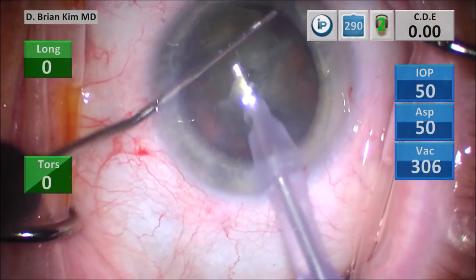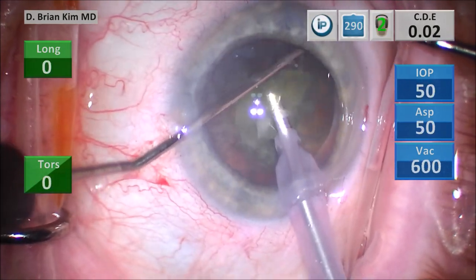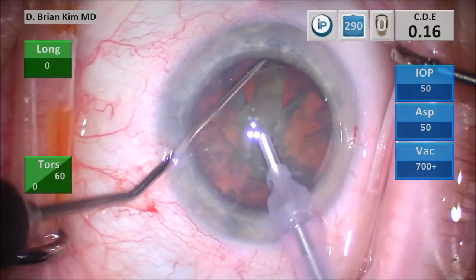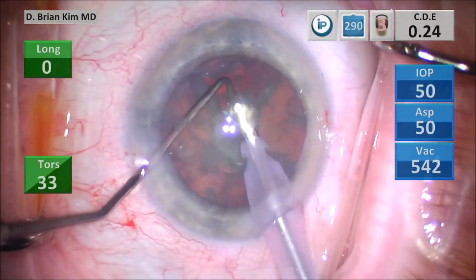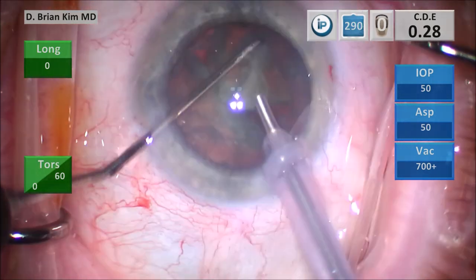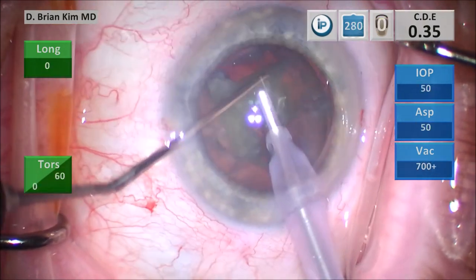I place the chopper out to the contralateral equator, crushing it, pulling it towards the center towards the phaco tip, and that crushes and divides the right hemi-nucleus. You can see that first quadrant just popped out of the bag, so I'm using mechanical fracturing forces to sandwich and crush the lens between the chopper and the phaco tip. I'm placing the chopper out to the equator again with a modified cross-chop technique, crushing the right hemi-nucleus in half, and this mobilizes the lens pieces.